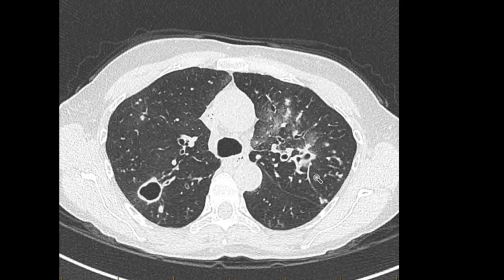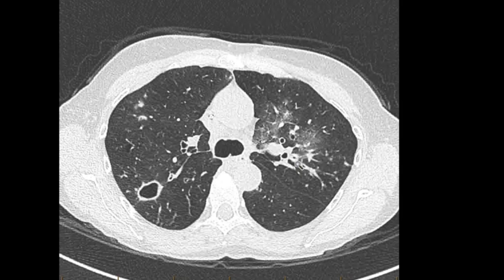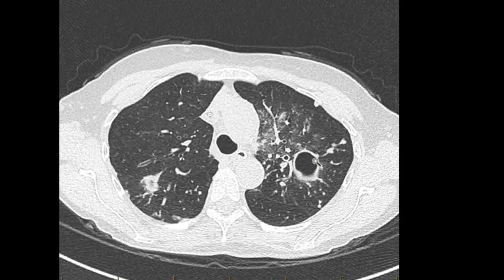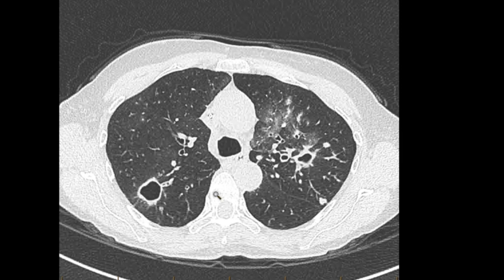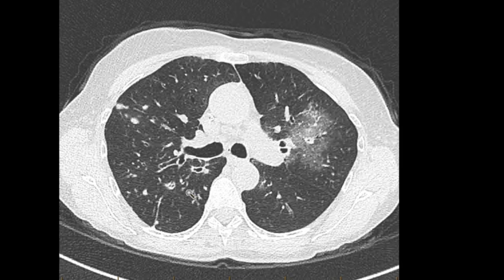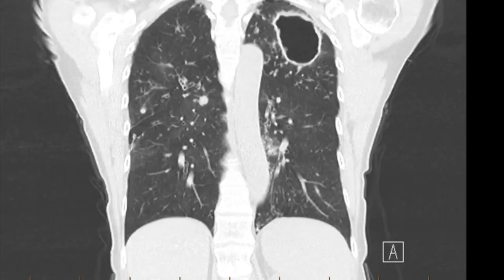There it is — there's direct communication from the airway into the cavity. So I wonder whether maybe this is not a cavity — maybe this is actually a dilated airway. Let's have a look at one of the other cavities. It looks as if this might also be communicating with an airway — there's a branch here from the right upper lobe going straight into this lesion which looks like a cavity. So the alternative, rather than these lesions being cavities, may be that they're actually dilated airways.